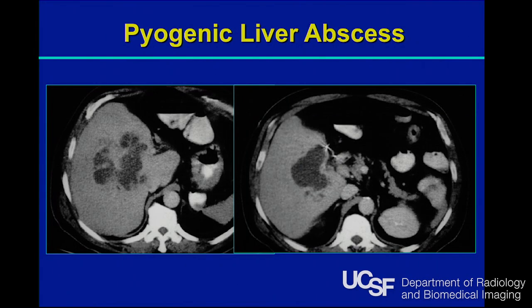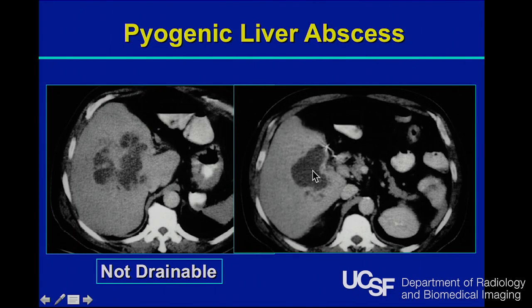And so dead liver doesn't really come out through the tubes, and so liver abscesses in an acute setting are actually not particularly drainable. But if you sit on it for a little bit, so this is just a week later, it coalesces together and becomes drainable, and actually responds very well to percutaneous drainage.